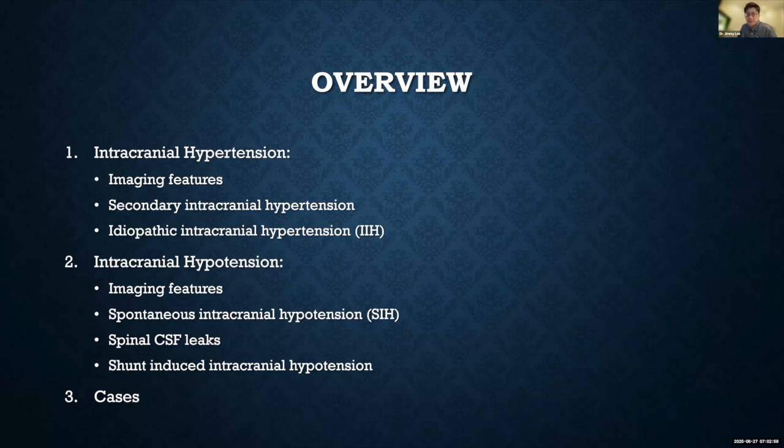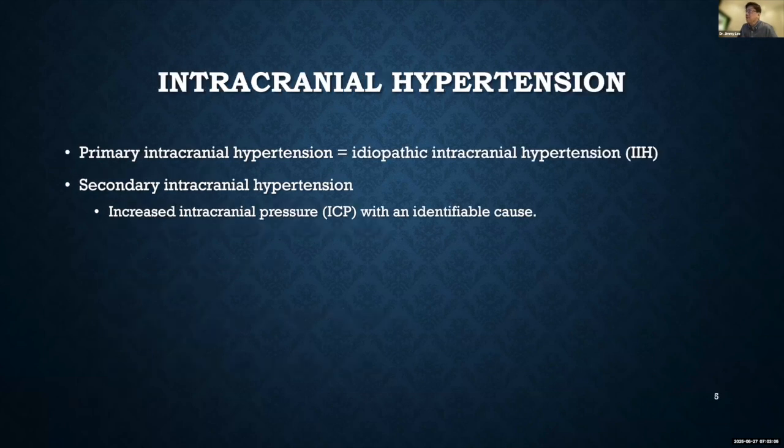And lastly, we finish with a few cases. I'll give you a few seconds to look at it. I understand the format doesn't allow us to talk directly, but I'll just go through some cases. Okay, so the first part is about intracranial hypertension.